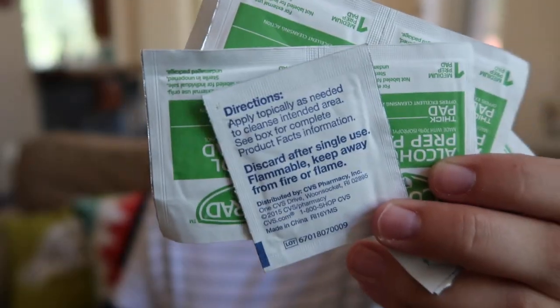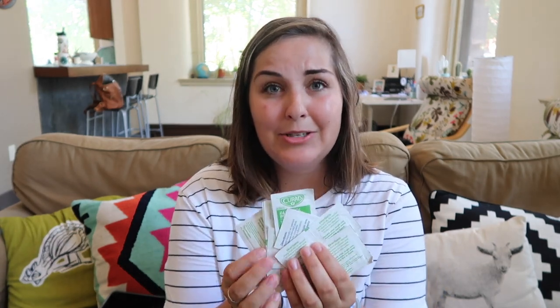The other thing I carry with me is alcohol swabs. I carry a bunch of these so that if I do need to change a pod, I can always clean off my site — the old one and the new one. I obviously have plenty in here; I have way too many.